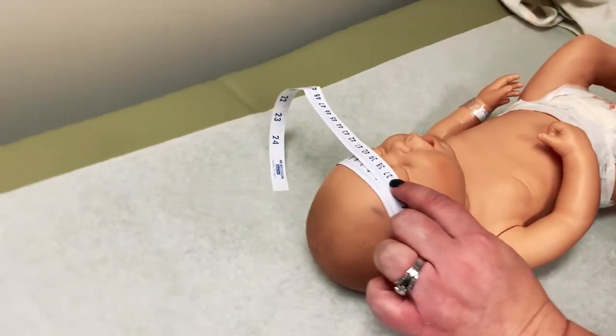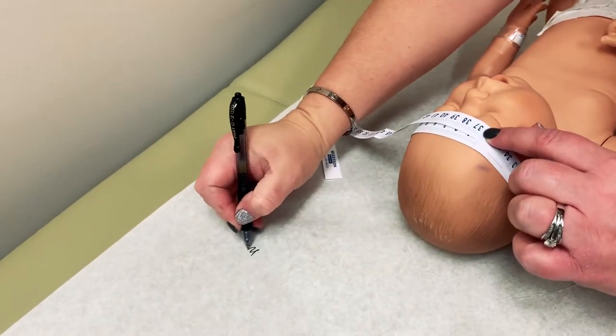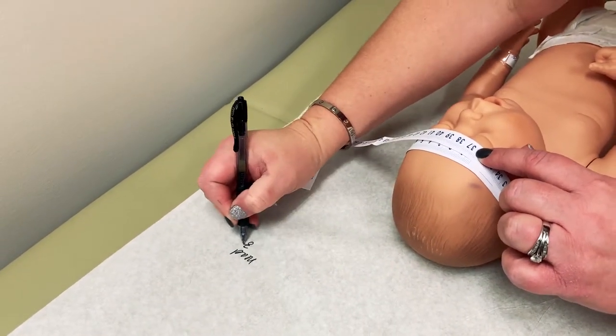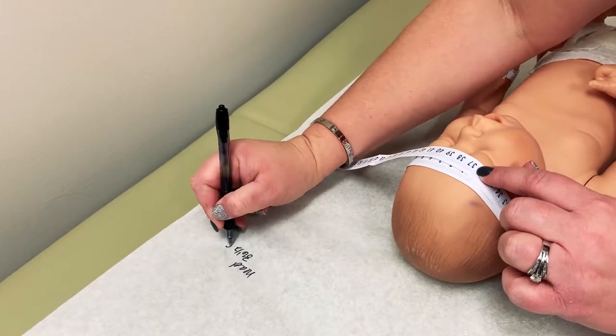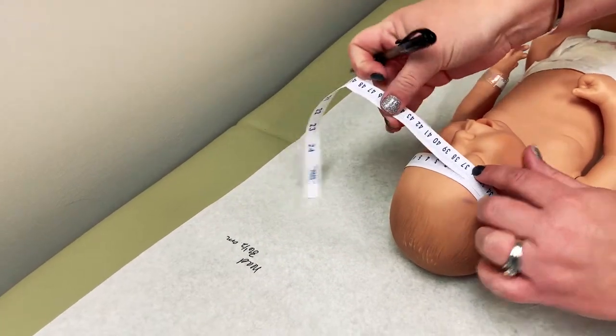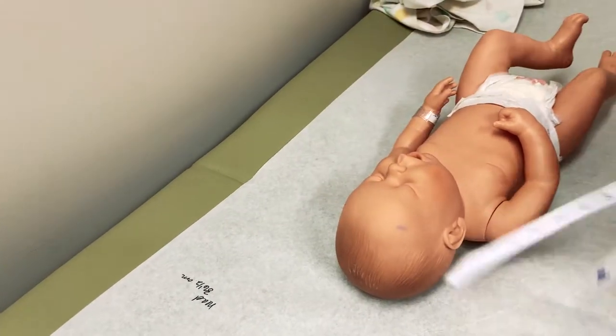Just so that I don't forget measurements, I usually will write their measurements along the side of the table paper.